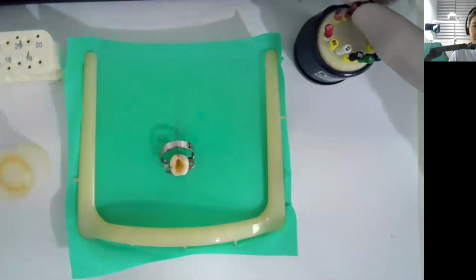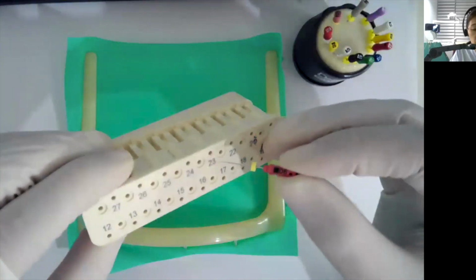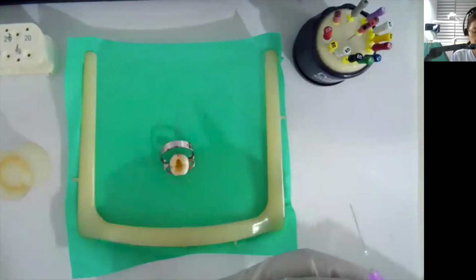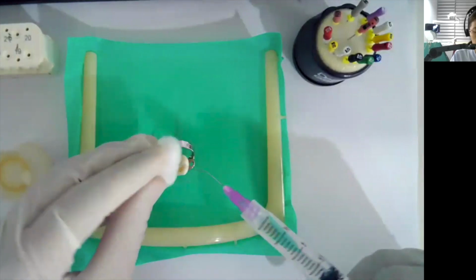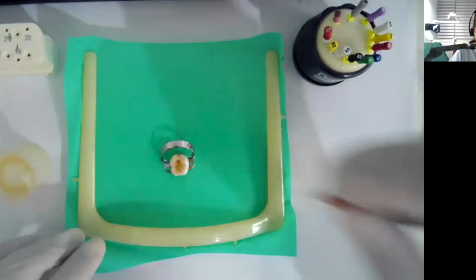So I'm going to get size 6 because the canal is very narrow, and I'm going to measure it at 23.5. Make sure that the canal is wet, because the rule is never work on a dry canal. So I'm going to irrigate. I'm using gauge 30 of the needle. And now I'm going to insert this 23.5 millimeters.